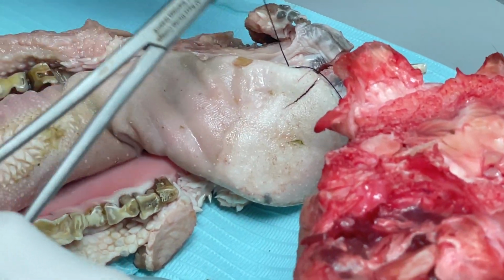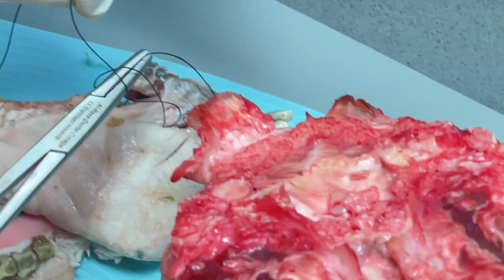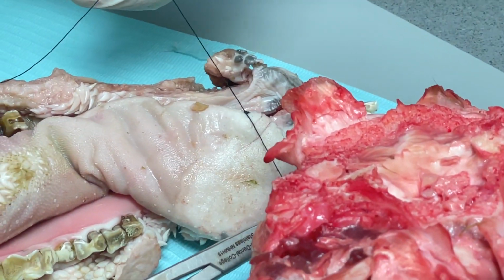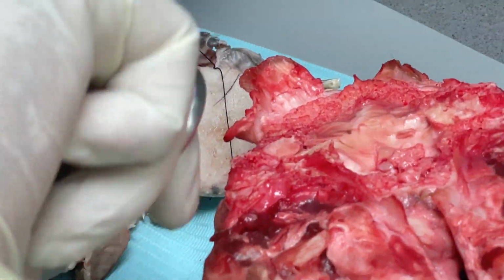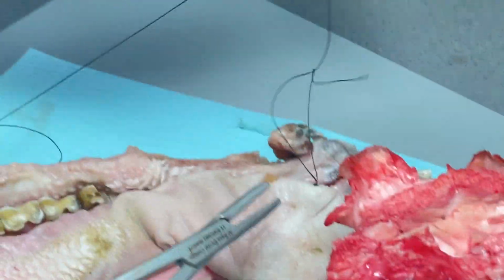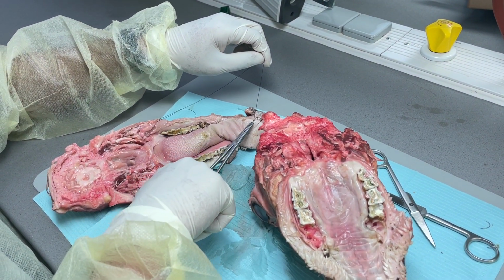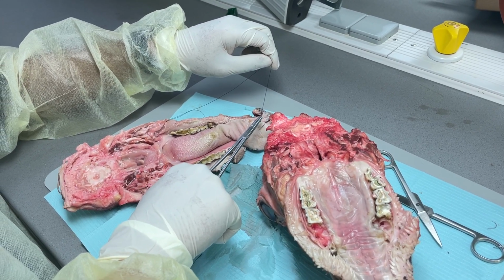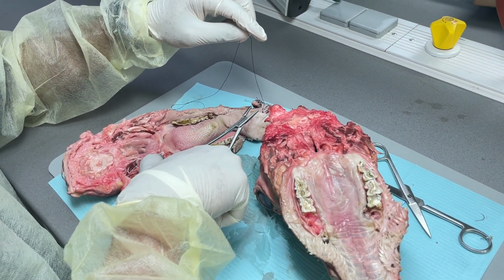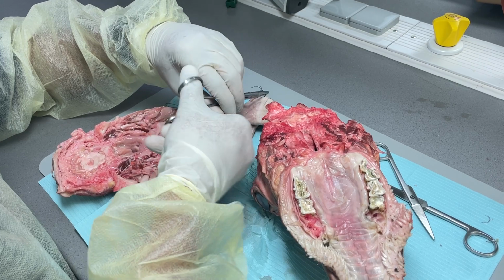Then anti-clockwise. Now see, sometimes what happens, when you are pulling it out through this loop, make sure the whole free end comes out. Sometimes otherwise what will happen? You will not take the whole thing out. You will end up holding like this, for example, you will hold this end here and you will try to pull, so that you will end up with an ear. Don't do that. Clear? And then, like I said, clamp it together. Now because I made the loop, that is why, clamp it together.